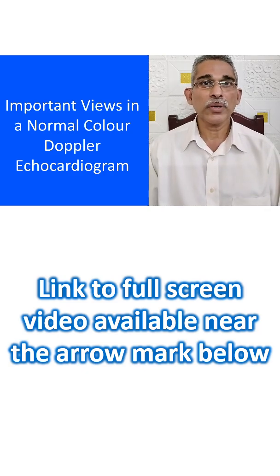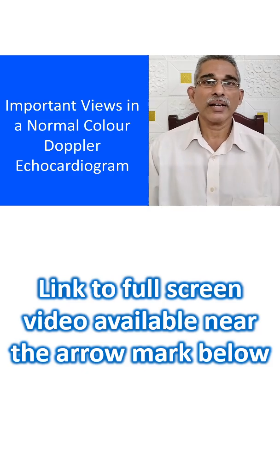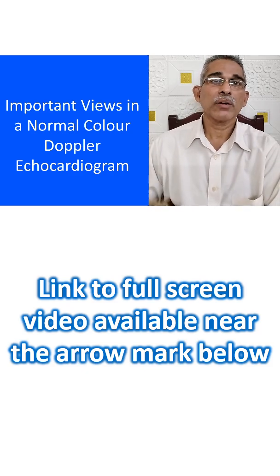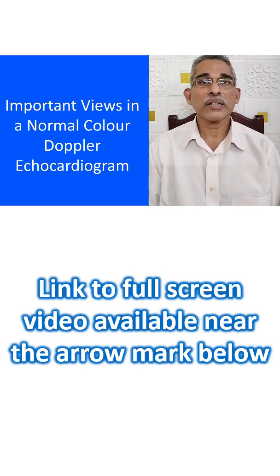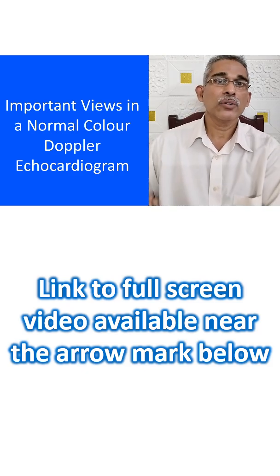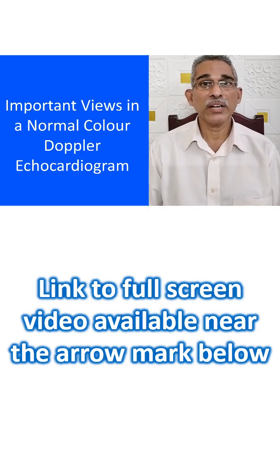Rarely, other views can also be used — for example, the right parasternal view to see the right atrium or a dilated right ventricle. A view can also be taken from the liver region, especially in post-operative patients where the central part is covered by dressing. There is also a view from the infraaxillary region, which is very useful for evaluation of the inferior vena cava.